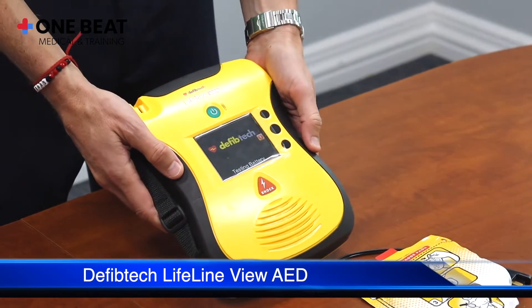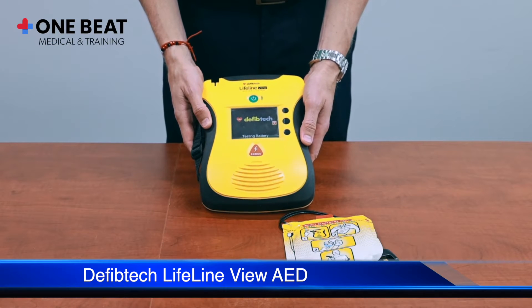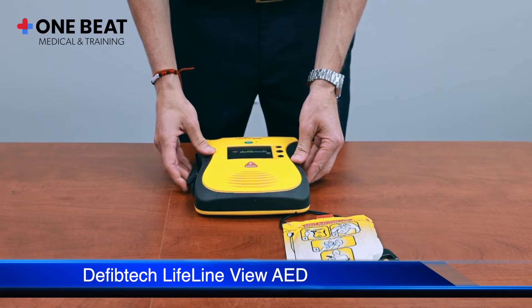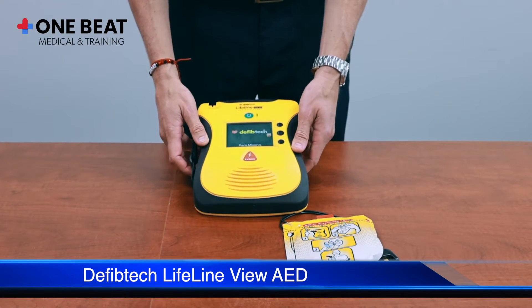Performing battery test. Upon insertion of the battery, the device will perform a self-test. The device announces: Battery okay. Pads missing. Powering off.